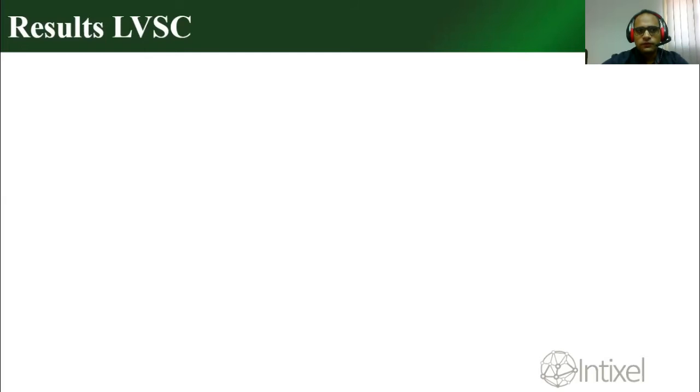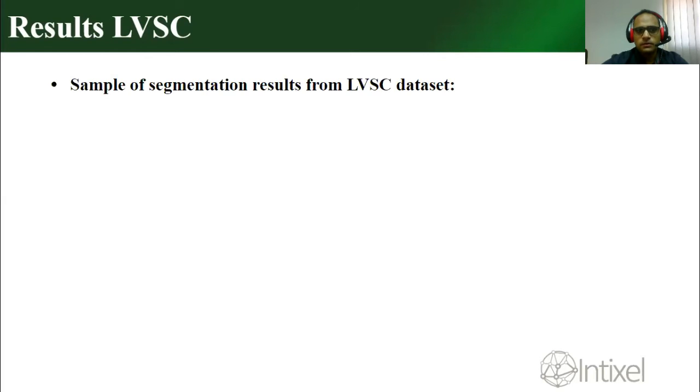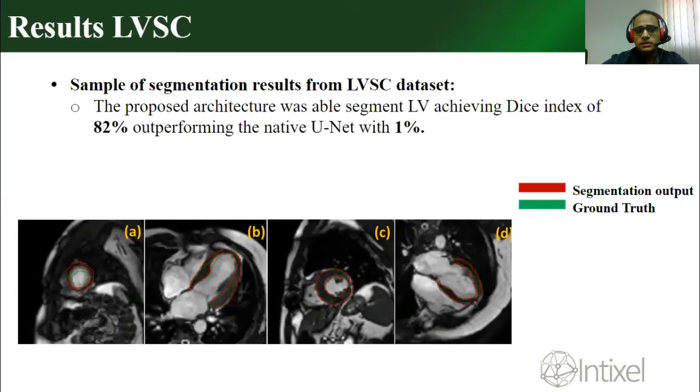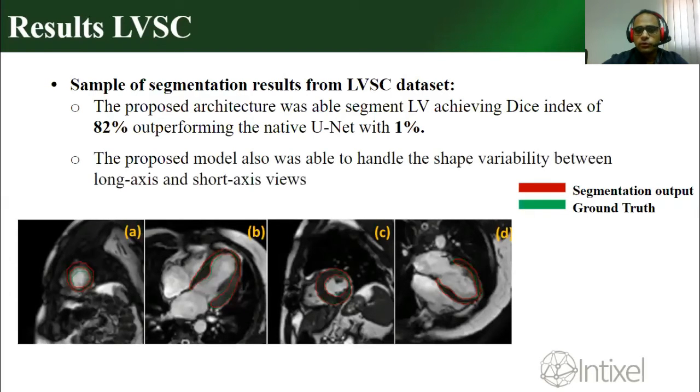So, the results on LVSC: we have shown that the proposed architecture is able to outperform the UNET in terms of DICE index by 1%. And it was able to segment both short axis and long axis views well.